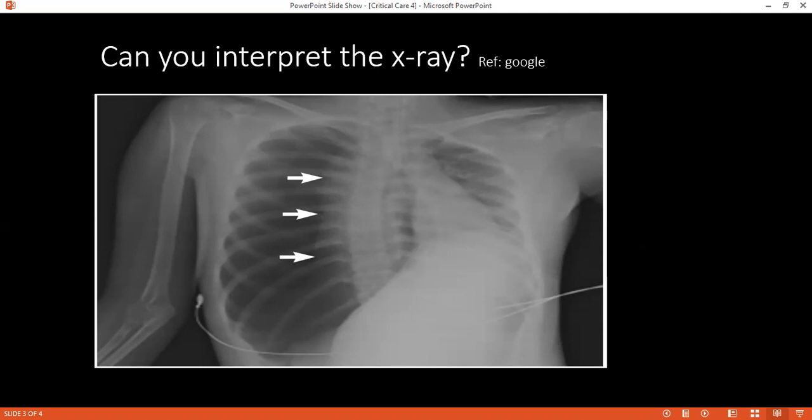How would you comment on the exposure? Whenever you have to read an X-ray in an exam, always read it in order: A, B, C, D and E. So what is A? Is the exposure adequate or not? The exposure is not adequate. What about the vertebral column, can you see it? I can see the vertebral column, but it is not so clear.